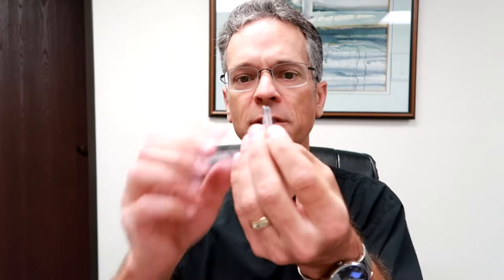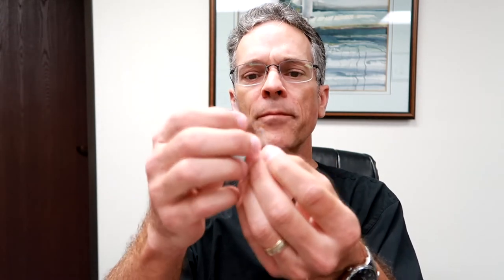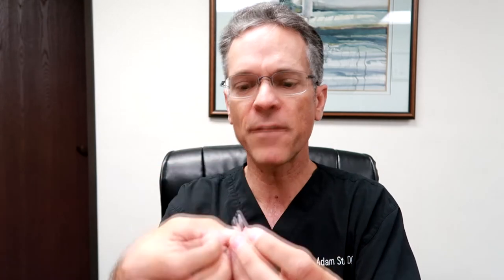In addition to that, it also comes with these little different scoopers. What these scoopers do is, if a person has an impaction of too much wax or a child put something in their ear, you can actually visually see inside the ear and then scoop it out safely, because these things are really soft.